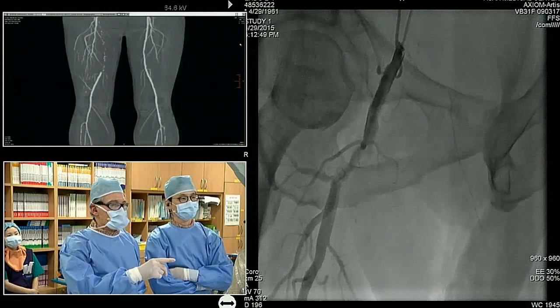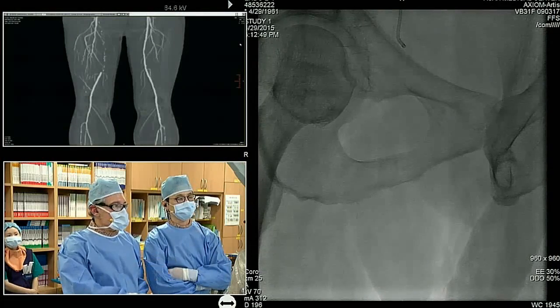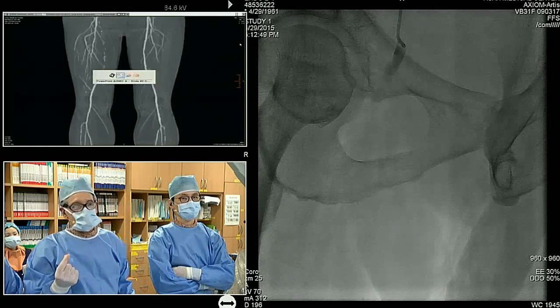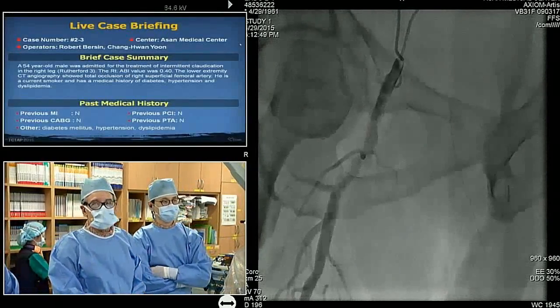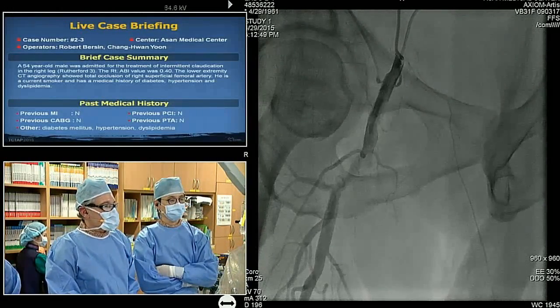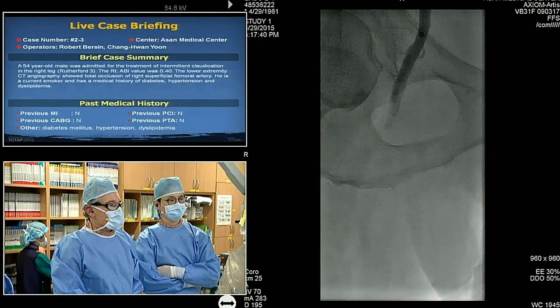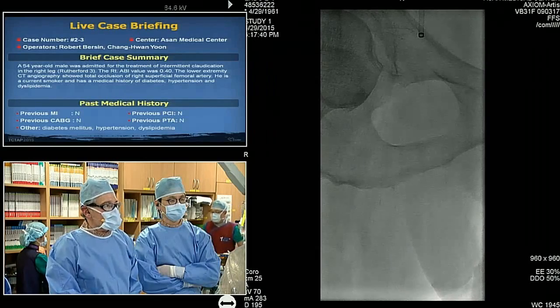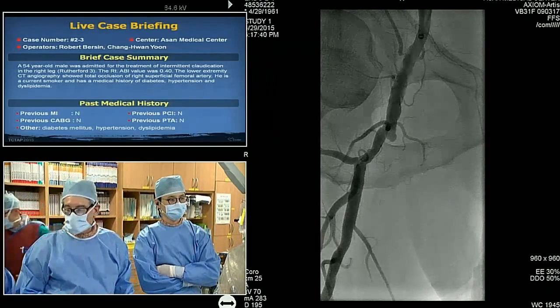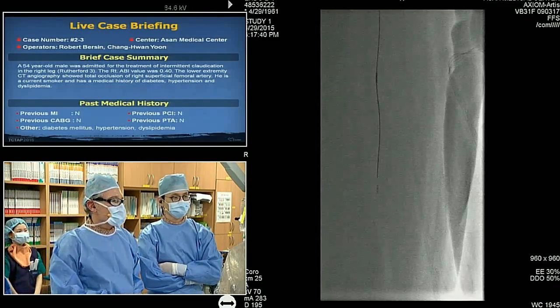Can you see the contralateral guide injection? Yes. Okay, so you can see there's just a proximal stump of maybe 1 centimeter at the most. Go on to the next. And this is now with the contralateral Ansel guide sheath in place. A little better imaging of that if you go to the next.